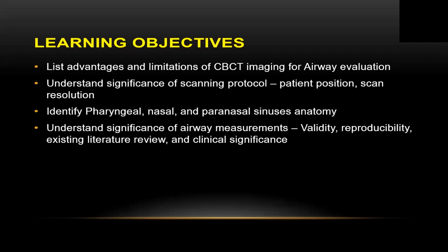And we will also look at current literature and discuss validity, reproducibility, and clinical significance of literature related to airway evaluation. There is a large volume of airway literature that is available. There's a lot of interest. Any good dental journal that you will pick up, pretty much every month there is a new article, new research, new interest that is being discussed regarding airway. So this is a really hot topic, and I'm glad we are discussing it today.